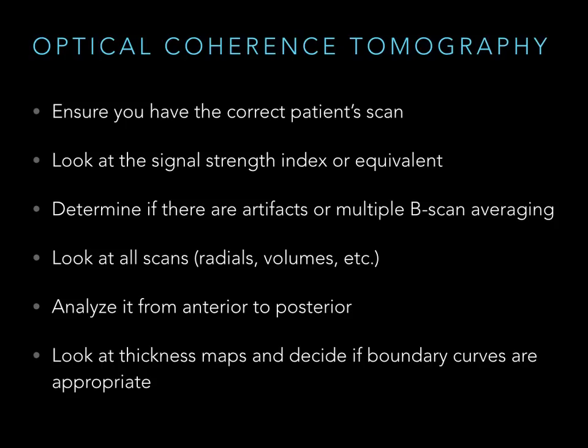Look at all the scans, radials, volumes. Look at whatever you have, especially if there's a question about somebody saying, hey, I think I'm having symptoms. They have a history of AMD. It's wet in one eye, dry in the other. Go back and look at the computer. Change the brightness or the contrast. Take it off of color. You never want to look at an OCT in color.